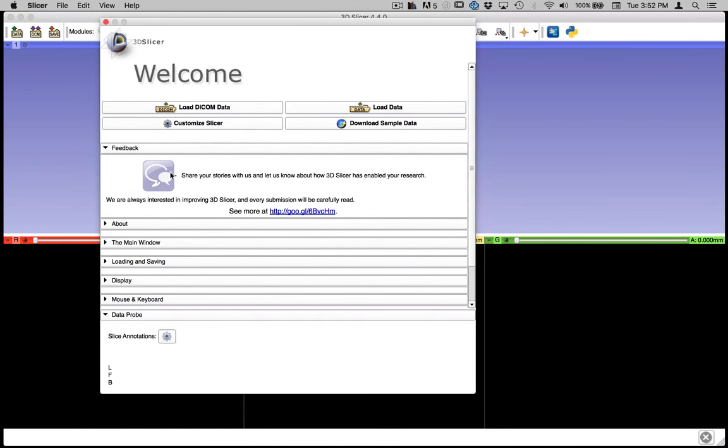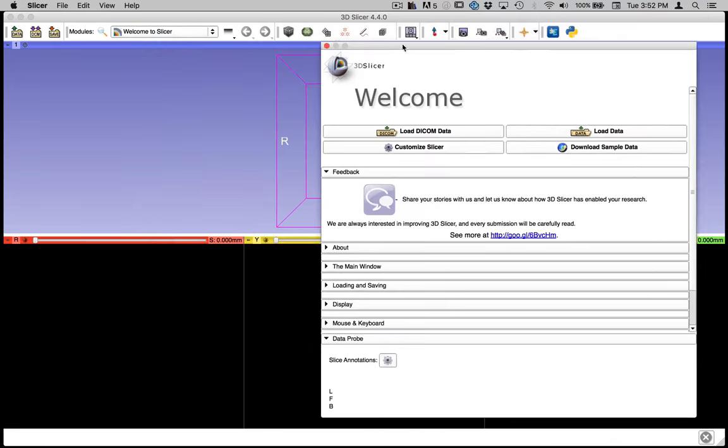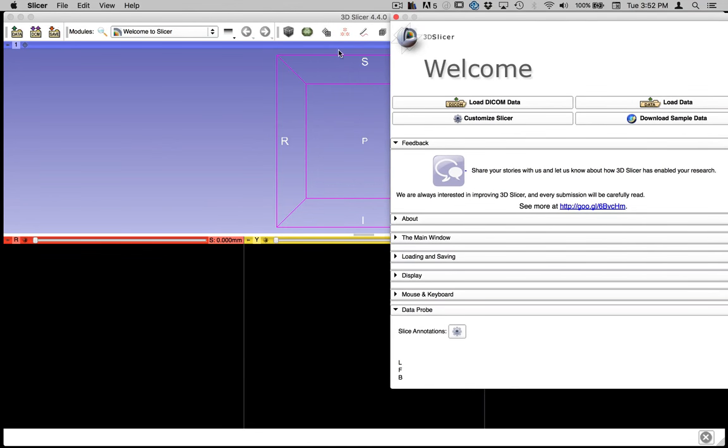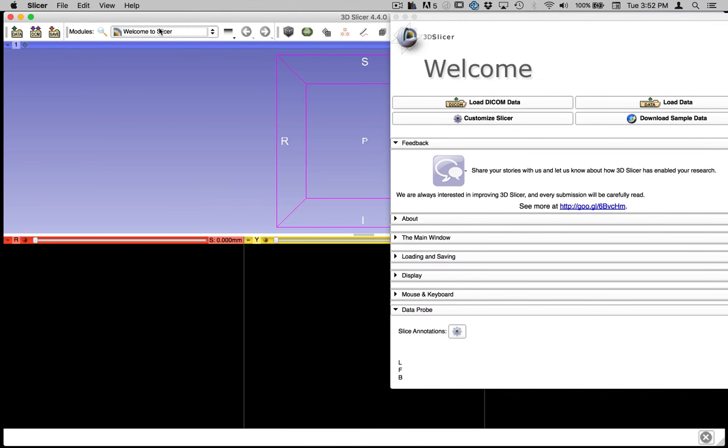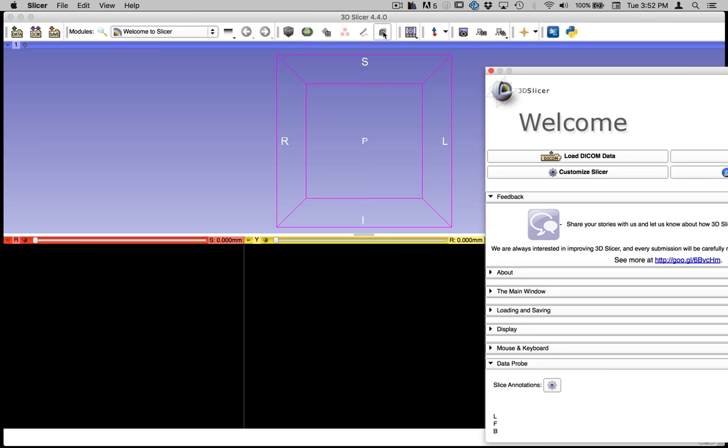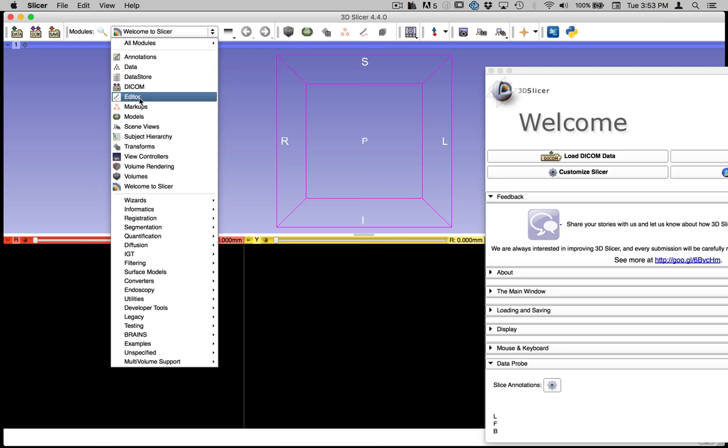But when it opens up, you'll see the first module and this is the welcome to slicer module. And this gives you some information about the project and how you can access their website and things like that. But all of the other modules that we'll be using can be found in this dropdown menu here. This shows the history of the modules you've used recently. And then there are some core modules that are listed here, and we'll be using some of these. In particular, we'll be using the volume rendering module, the editor module, and the model making module, which we get to through the editor.